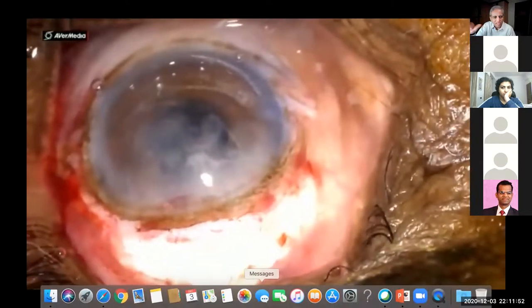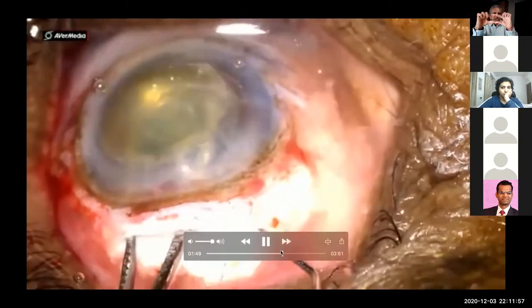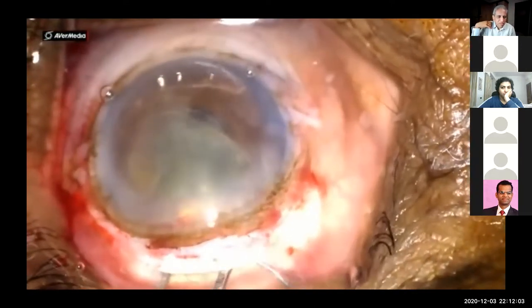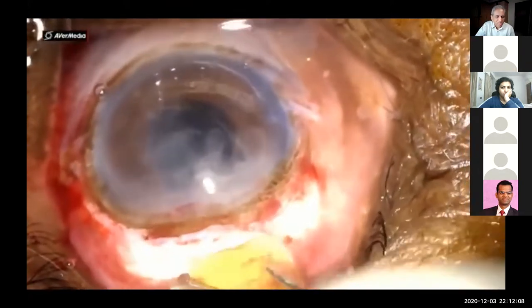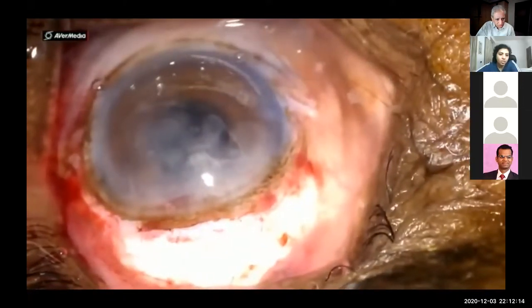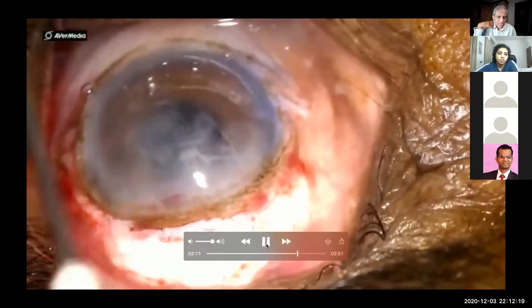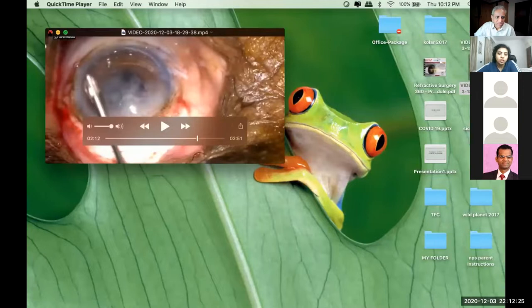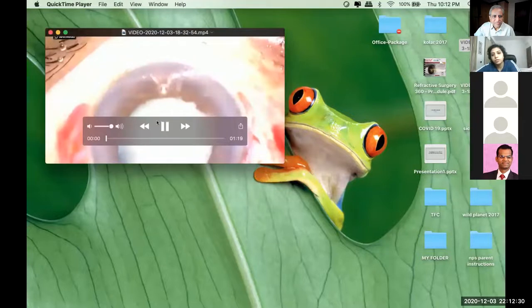So this is only understanding the geometry of the anterior chamber, which is plano convex, and understanding the geometry of the nucleus, which is biconvex. The nucleus is more curvaceous posteriorly than anteriorly. It's got a steeper curve backwards when compared to the front. So you'll have to really go backwards parallel to the nucleus to reach the lower pole and see that the nucleus remains in the center of the anterior chamber throughout. These are tiny tips that I can give. The length of the scleral tunnel also is too long. Probably that is making the maneuvering even more difficult in this case.